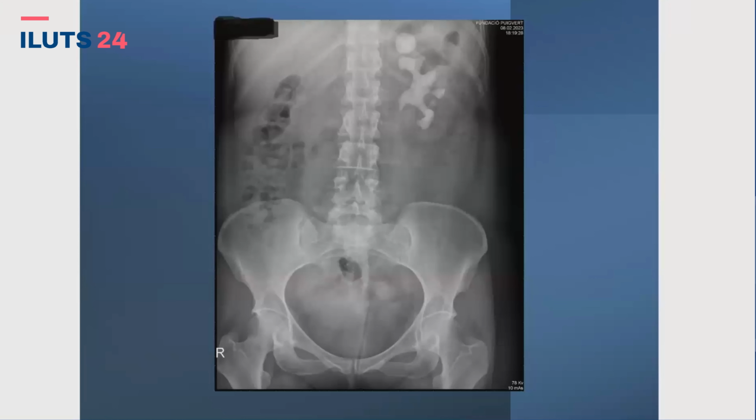So it's a struvite stone, an infective stone, and right now we have a staghorn. It's an infective stone. It's in the lower calyx and has a wide infundibulum. So I think that an infective stone in a good lower pole is perfect for shockwave lithotripsy. It's possible with postural measures after. But you mean right now, before the first case? In the first case, you're right. In the first case, we were checking if there was a connection between the diverticulum and the rest of the kidney. That's why we performed flexible ureteroscopy.